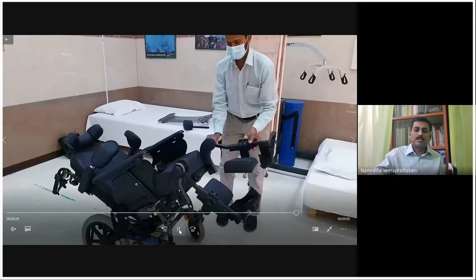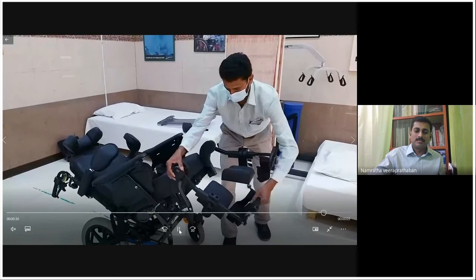You can see the elevating angles. You can bring it to 180 degrees.